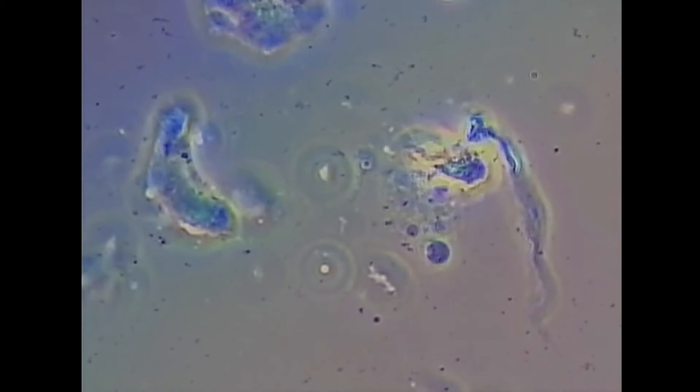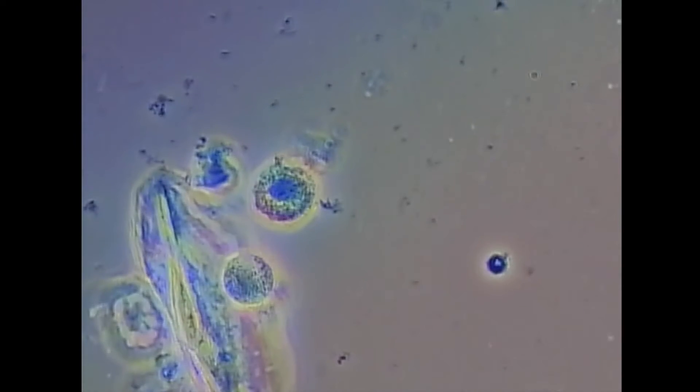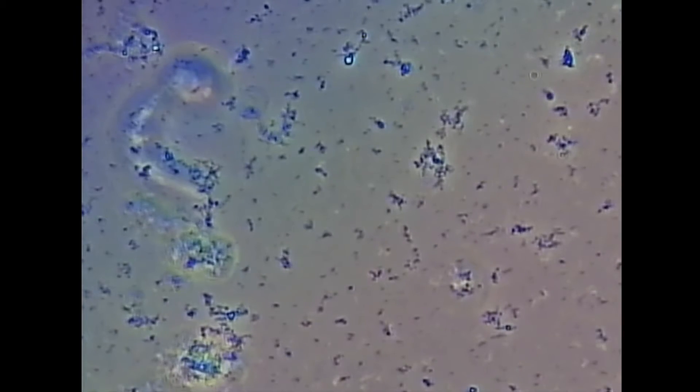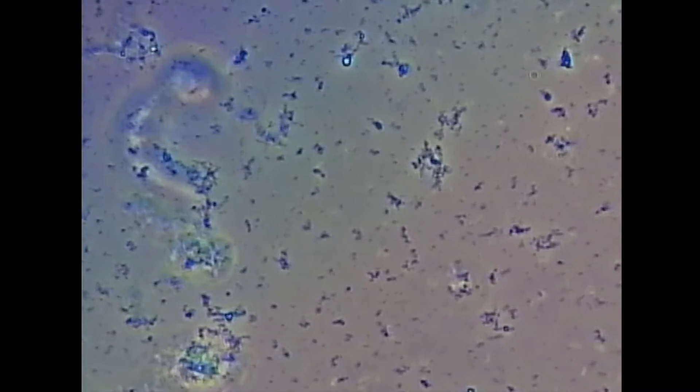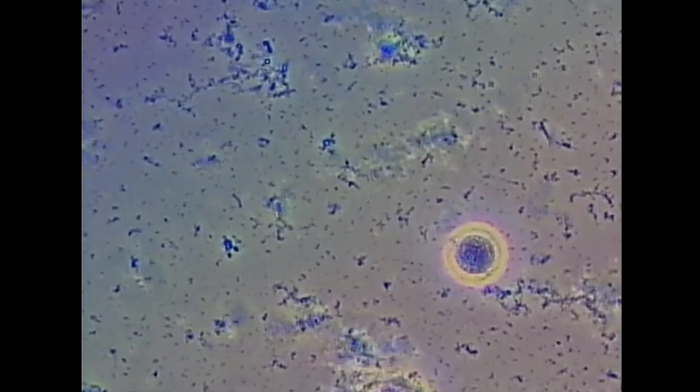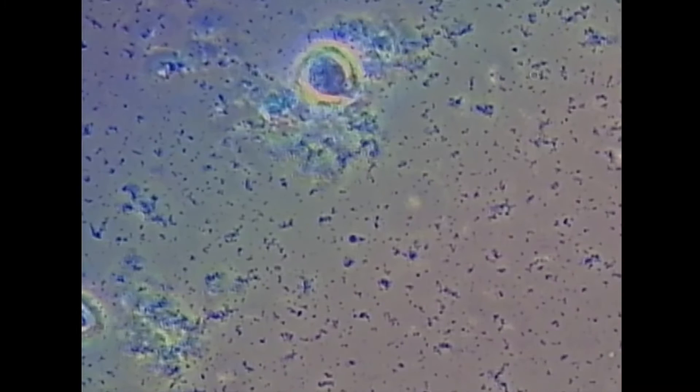I brought my patient back in for a post-op. She had laser-assisted periodontal therapy six weeks ago. Her periodontal concern was trichomonads and spirochetes, and we know from McGlossi and McDonald's work that spirochetes are bad systemically, especially for dementia, and of course all the things we know periodontally speaking from the dental literature — spirochetes are not supposed to be in your mouth.